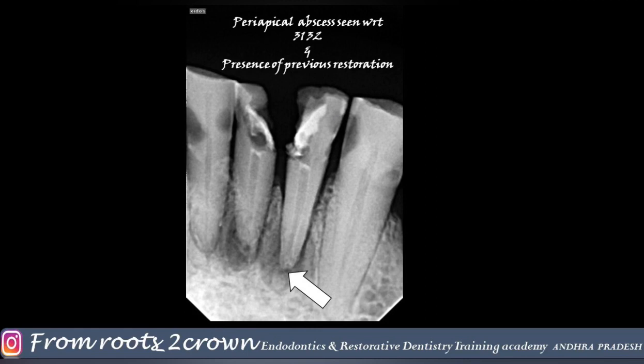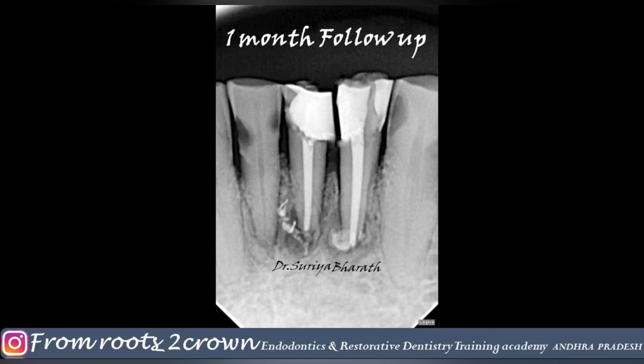After a master cone check, as apical resorption had been observed, we placed BIOSTRUCTURE MTA putty material, followed by filling the entire canal with backfill, and we sealed the tooth and advised the patient to revisit after 1 month.